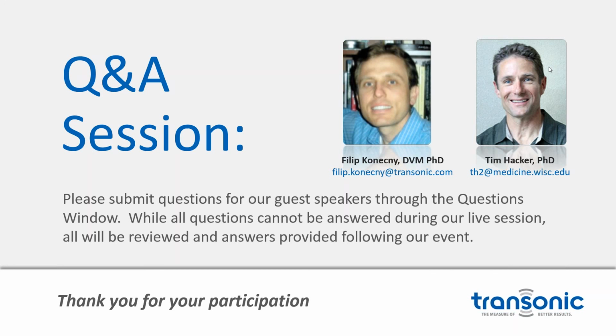And I also stress that this is longitudinal, it's not a snapshot, so every beat's captured. You turn the pump on, you capture the beat immediately when you're turning the pump on. You are not able to do it with echo, otherwise you will spend a lot of time to do longitudinal echo, but again you don't have the ability to store the longitudinal cine loops for over 100 beats. PV might help you in this.